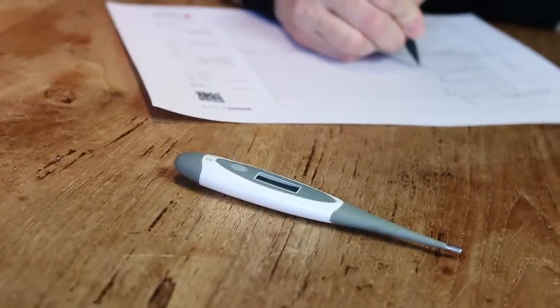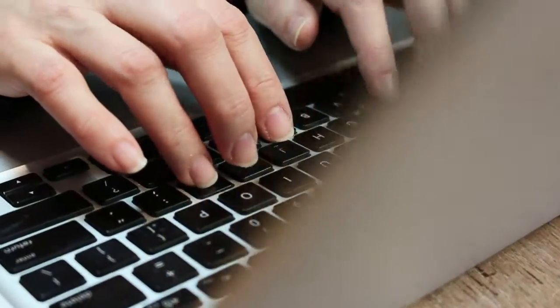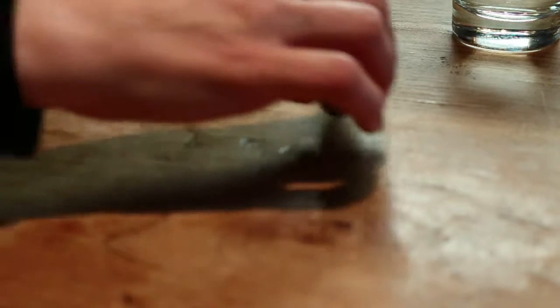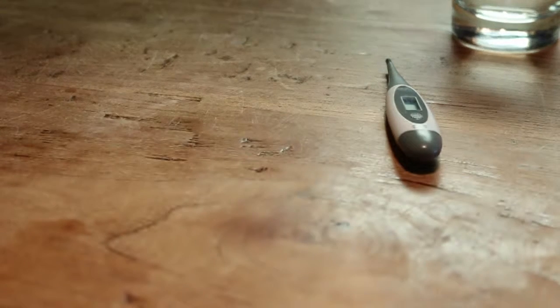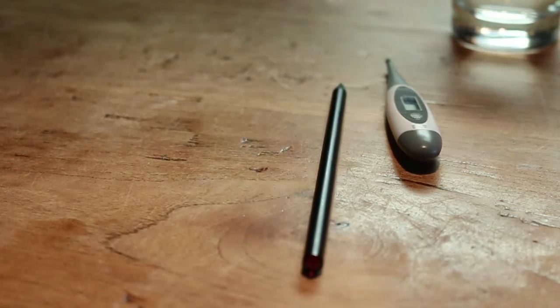You have heard of Sensiplan. You would like to know more. You would like to know what you need in order to get started. You will need 3 things: a digital thermometer, a pencil, and a piece of paper.